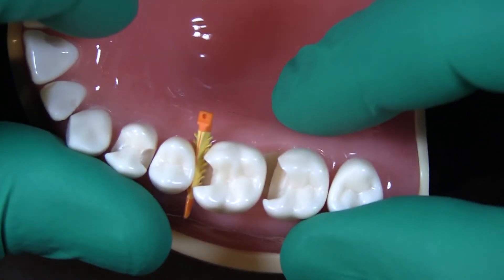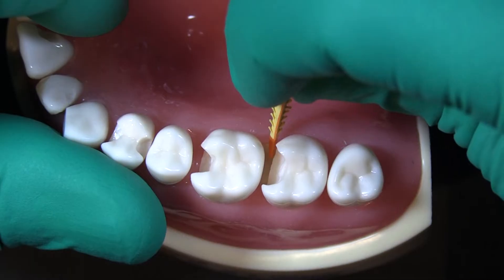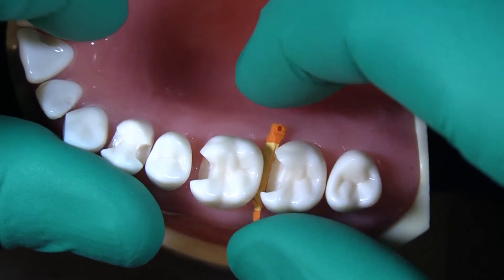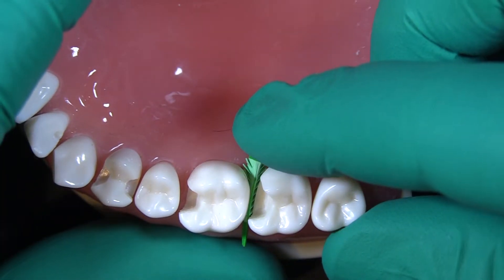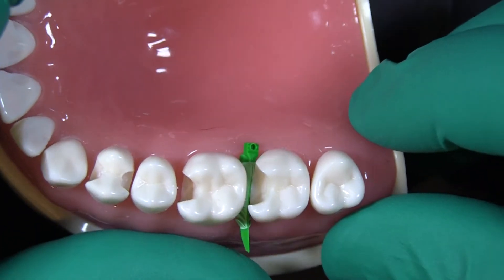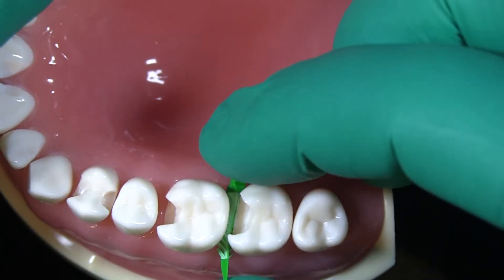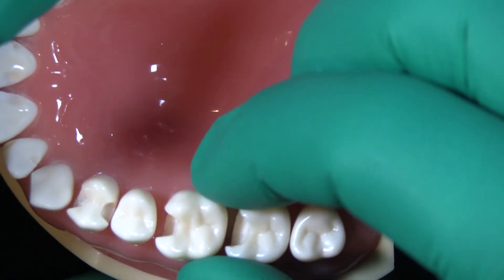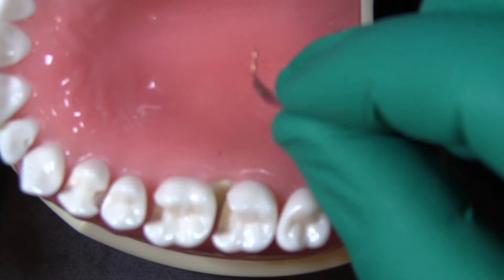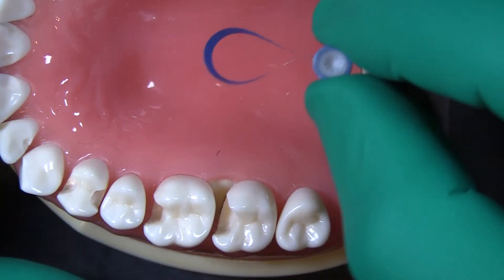I have two options at this point. Option one is I can remove some gum tissue to make space to get my wedge in there deeper. Now you can see this wedge is a little too small for this situation — those fins are engaging into my preparation — but when I put a matrix band in there, that wedge is going to push the matrix band up against the tooth. The other option is to use a different type of matrix band that's going to seal, and that's really where the difference between using a sectional matrix band and using a constrictive matrix band comes into play.